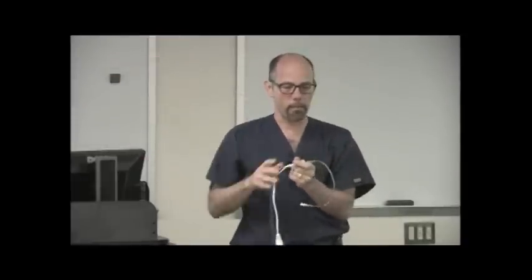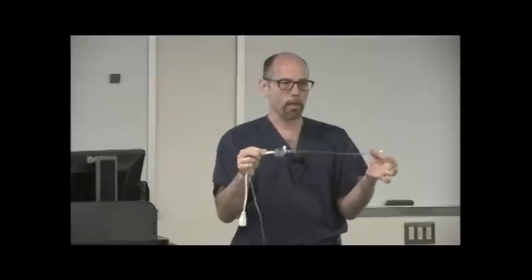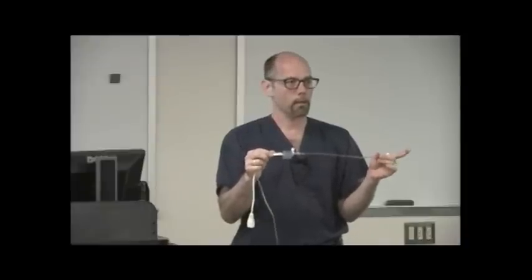So I can just take this tubing right here and kink it right over, occlude it. If I try to do that with this tubing, it doesn't ever kink. It's called high pressure tubing. Why would I want that kind of tubing between the catheter and the transducer and not care about the tubing that goes back to the IV solution?